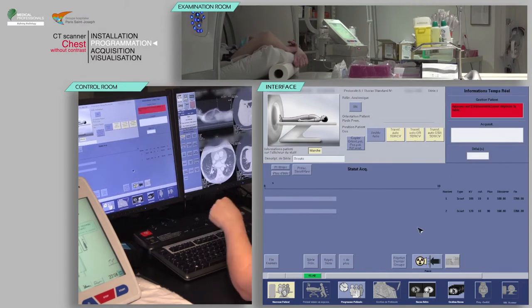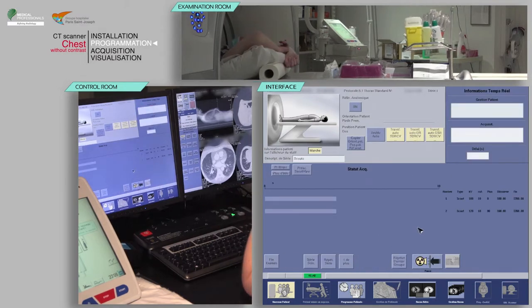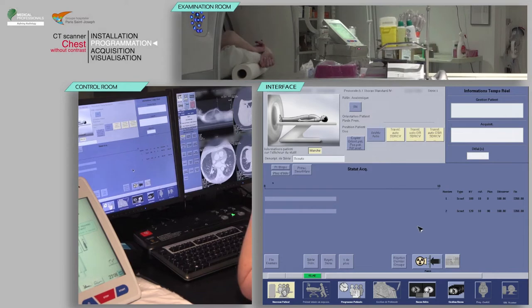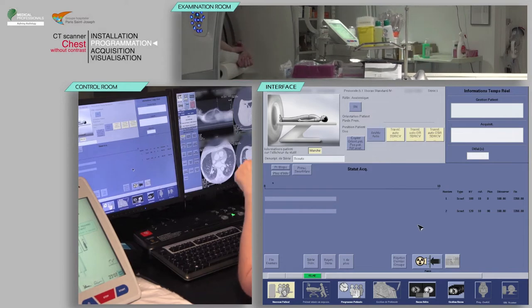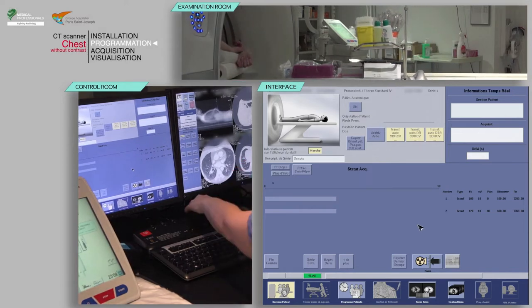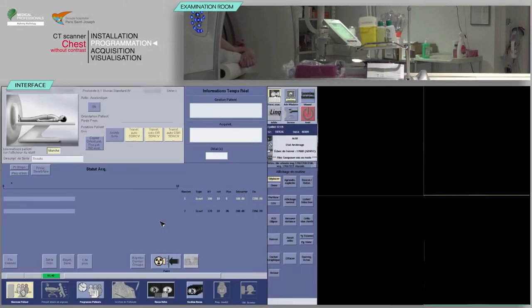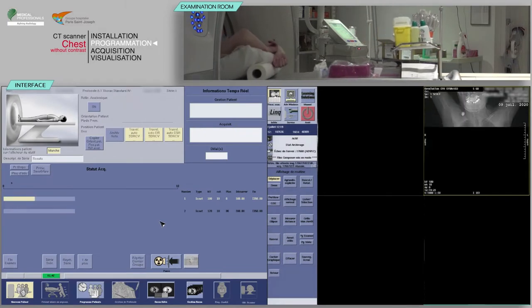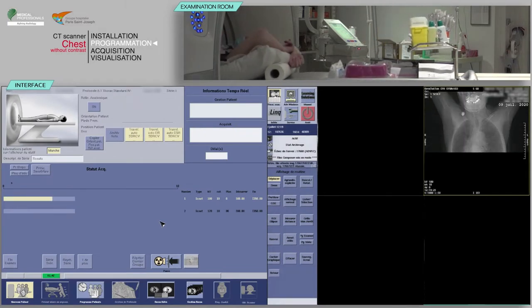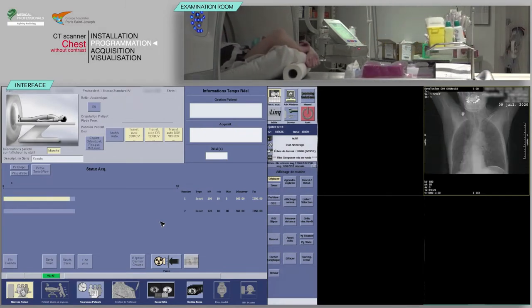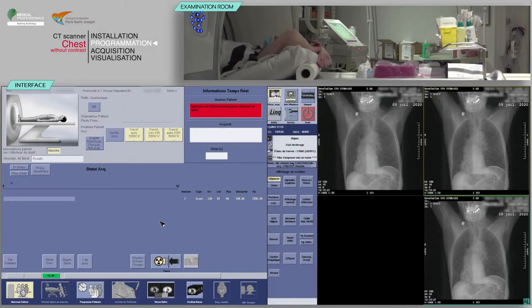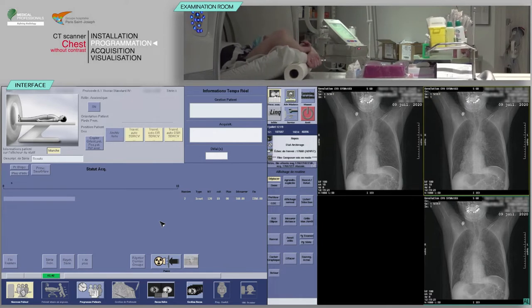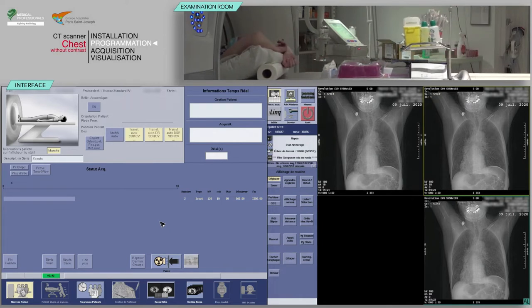On the keyboard, move the table and launch the acquisition when the buttons flash. Repeat to obtain a lateral view.